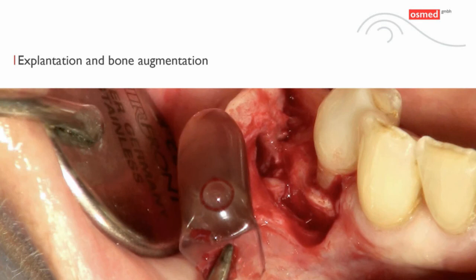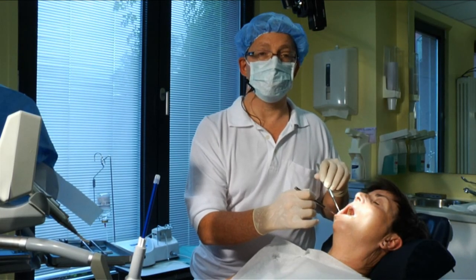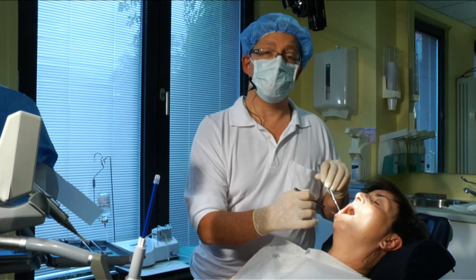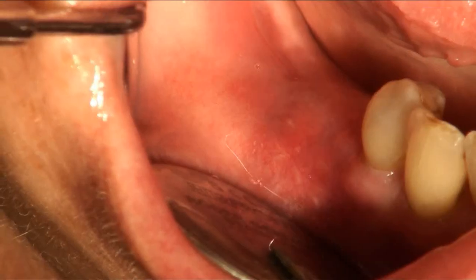Explantation and bone augmentation. Well, today we will perform second stage surgery in this patient who underwent the first stage surgery 4 weeks ago.